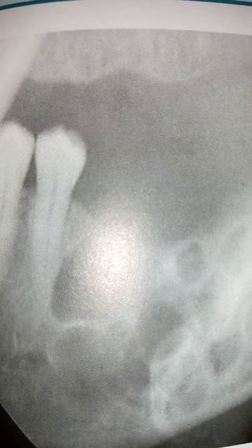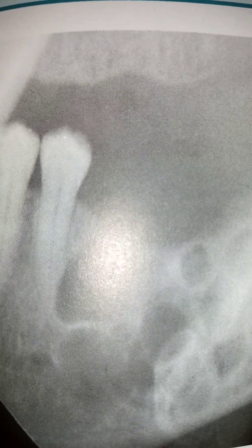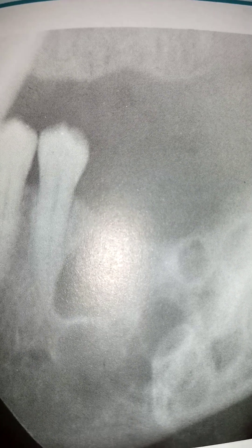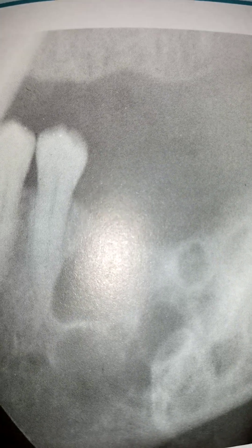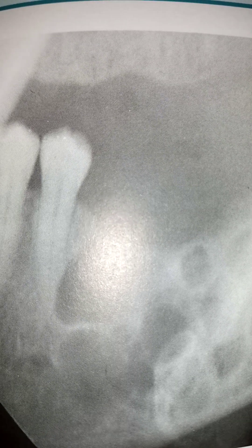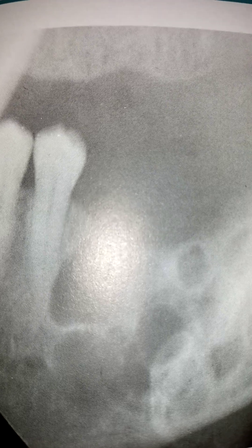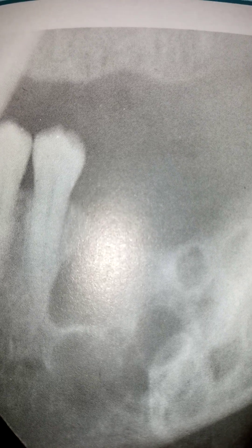This is a radiograph of an odontogenic keratocyst with multiple locules. As we can see, there is cortication around each cavity. This radiograph resembles an ameloblastoma, though the lack of expansion gives us a clue to the correct diagnosis.